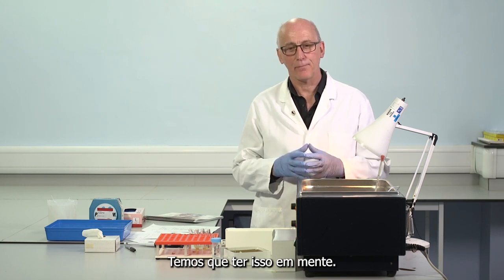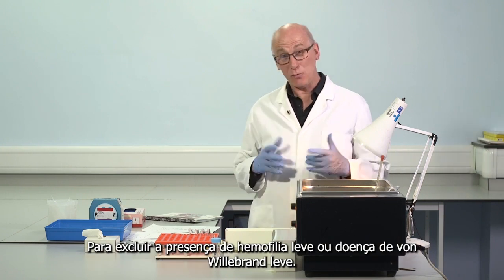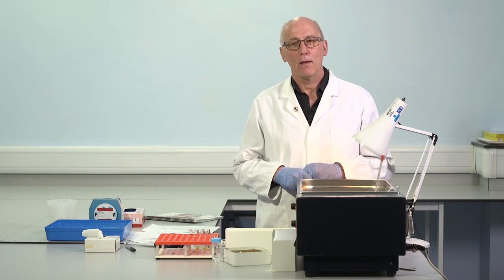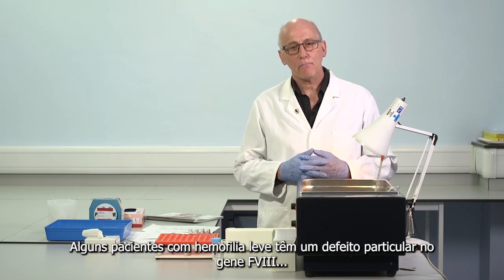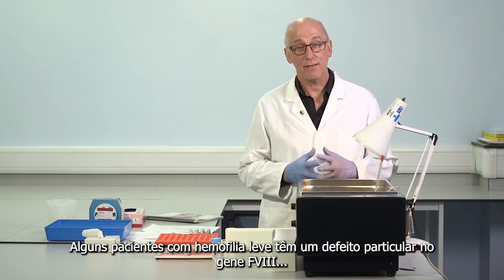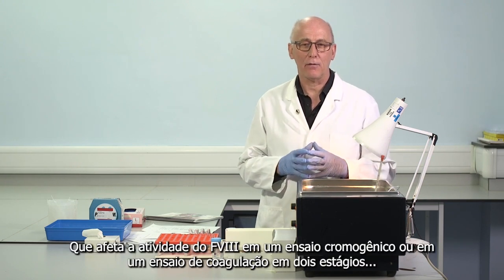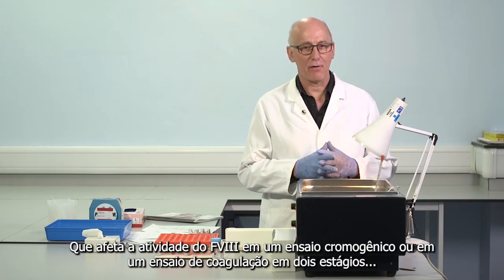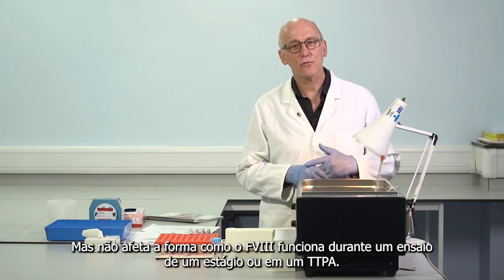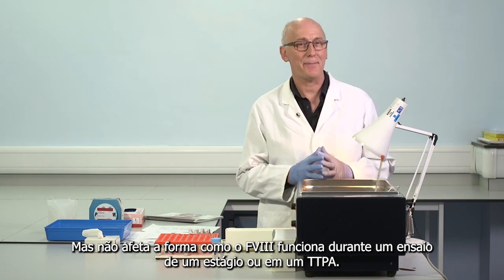We have to keep that in mind. It's one reason why we can't use a normal APTT to exclude the presence of mild haemophilia or mild von Willebrand's disease. There is another reason. Some mild haemophiliacs have a particular defect in the factor VIII gene, which impacts on the activity of factor VIII in a chromogenic assay or a two-stage clotting assay, but doesn't affect how the factor VIII works during a one-stage assay or in an APTT.